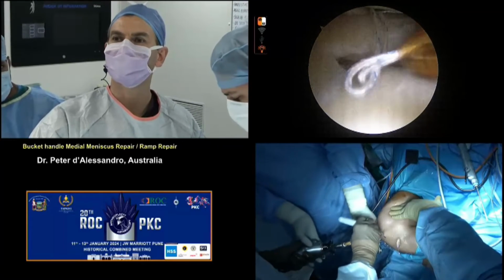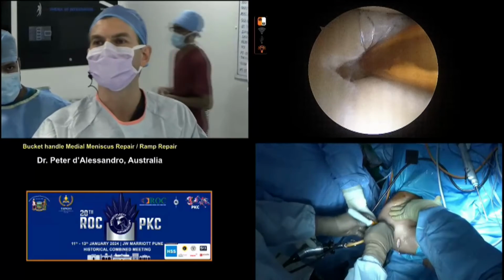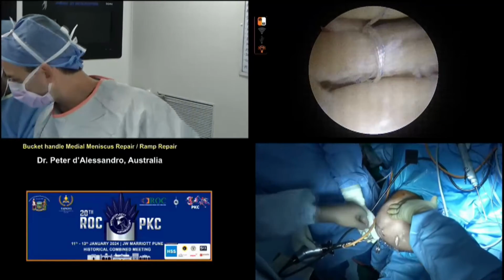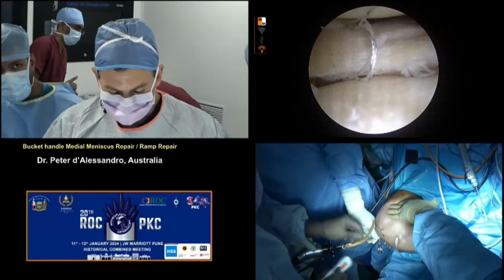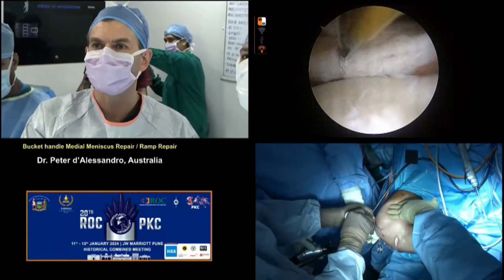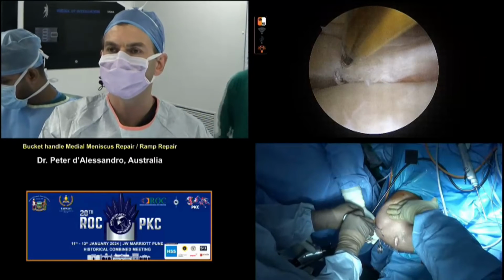Yeah, I must admit, Cassie, I've not found that it's been an issue at all. Maybe I just don't ask them enough. We've got another 2 of those guys. But the whole posterolateral pain, I think, particularly at the hiatus here, that popliteus tissue is the best tissue I've got to try and stabilise this pretty tenuous lateral meniscus.